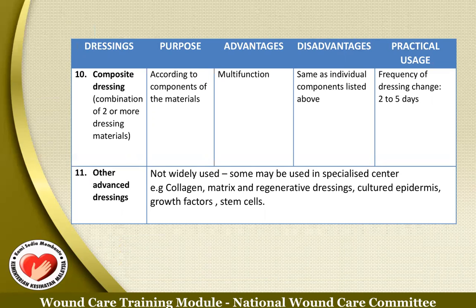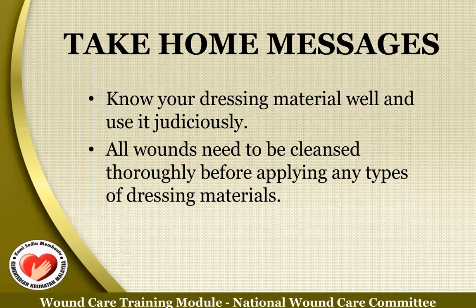There are a few other advanced dressings which are used, such as collagen, matrix and regenerative dressings, cultured epidermis, growth factor, and stem cell. So the take-home message will be, know your dressing material well and use it judiciously. All wounds need to be cleansed thoroughly before applying any type of dressing material.